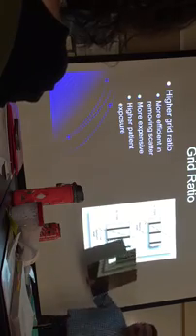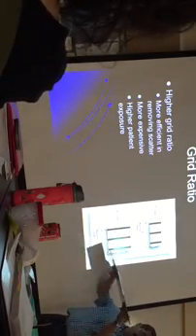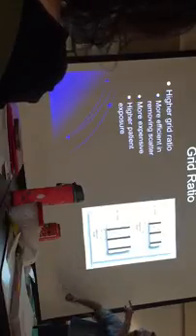What is being shown here is not the grid like this. This is not what you're seeing. You're seeing it like this. It's a cross section of it. And so the lines are there, or in this case, like this. Make sense? And so in 1 centimeter, you're going to split 2 of this. And so when I said the taller this is, I'm talking the thickness of this grid. Okay? Is that clear?